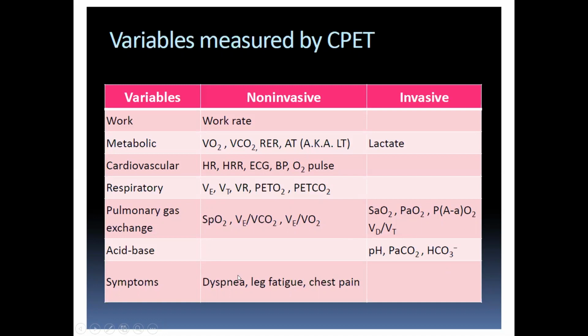And then symptoms are very important. I'll tell you why. Most patients who have cardiac limitation stop exercise due to leg fatigue. It's not due to dyspnea, actually. Ventilatory limitation, predominantly they stop due to shortness of breath. And chest pain, as you know, that is a marker of myocardial ischemia, so that's also important to know.